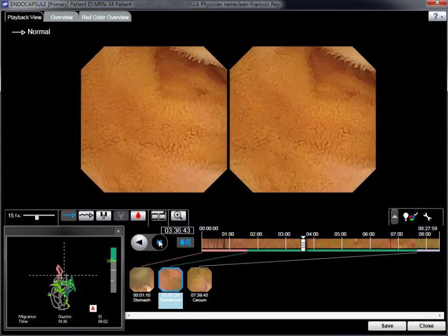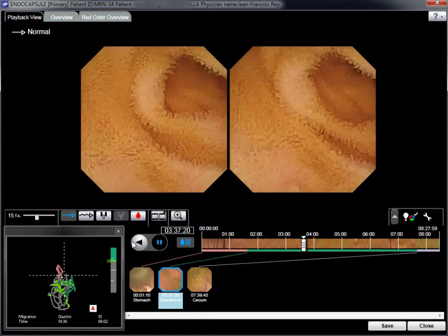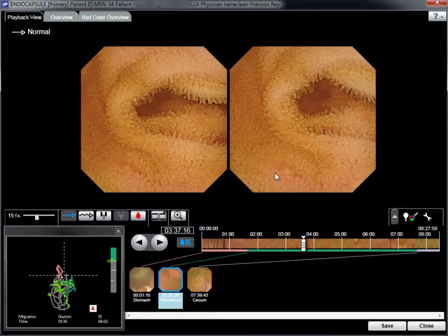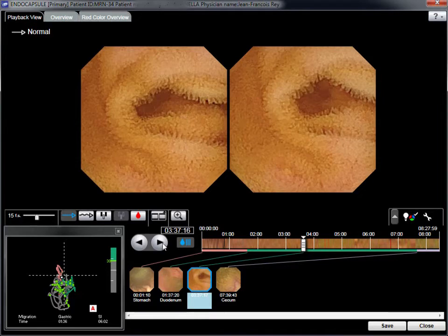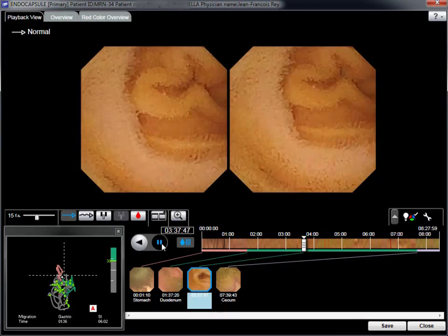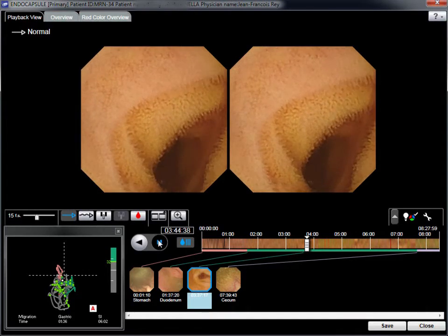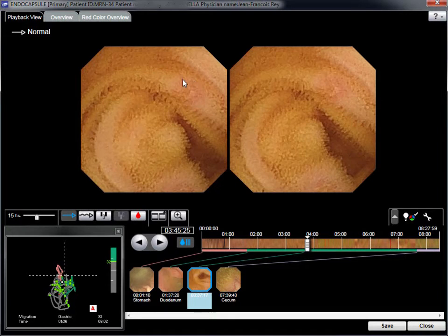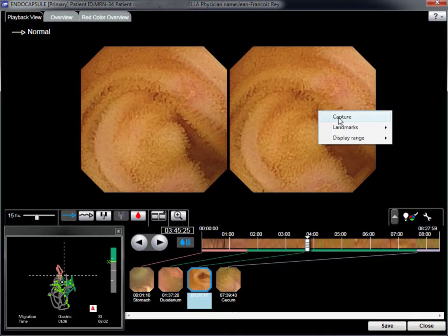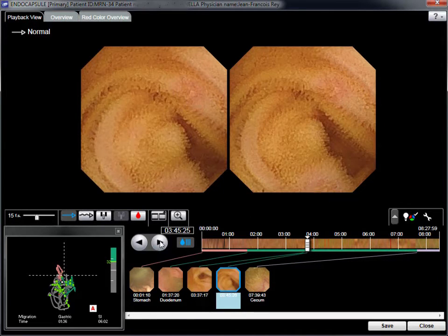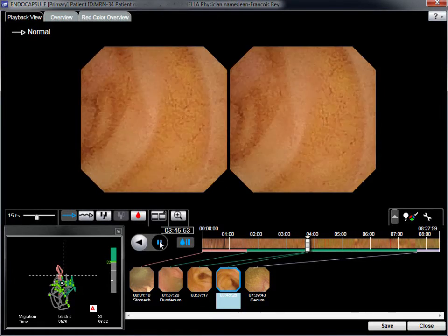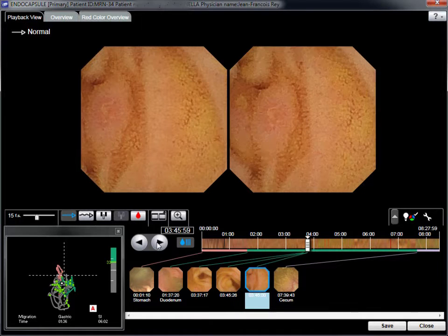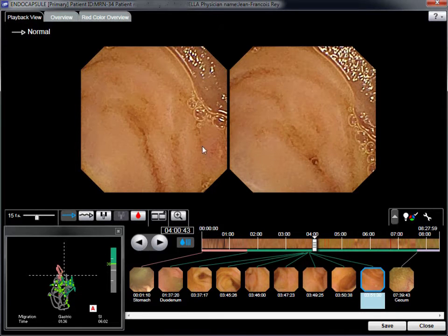Images are captured as thumbnails. In the distal ileum, fluid and debris are indirect signs of potential stenosis. Ulceration is clearly visible with a tight stenosis.